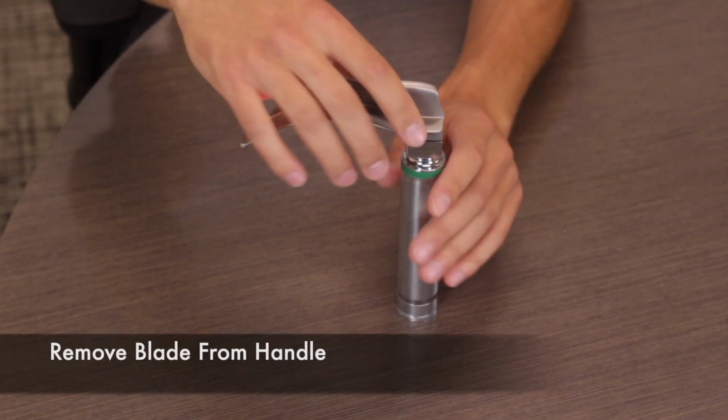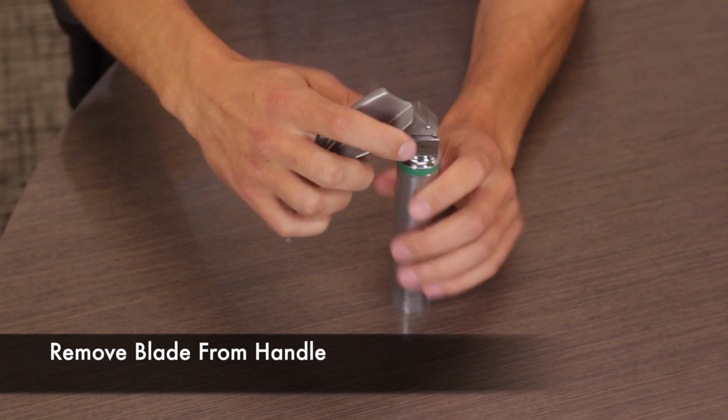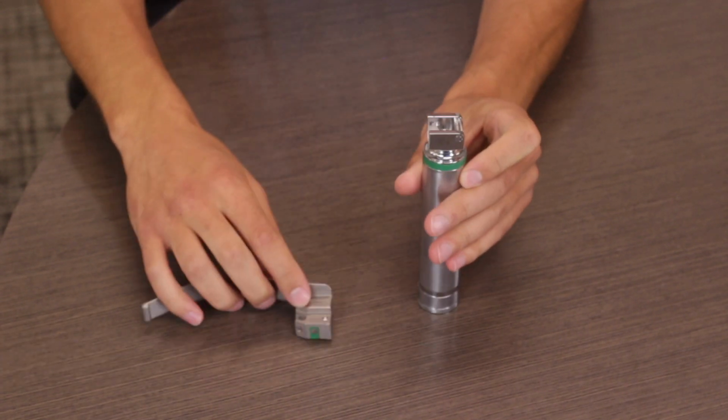Alright, SunMed users, today I'm going to go over the recommended ways to disassemble and reassemble a SunMed reusable laryngoscope for disinfection and for sterilization. First step is to remove the laryngoscope blade, to disengage and remove.